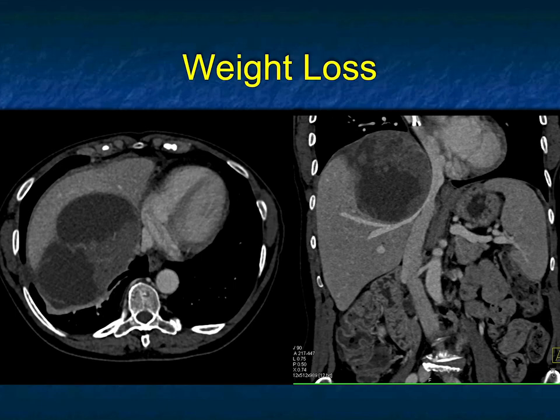The patient has already had a TAH and BSO. This was metastatic ovarian cancer. It's not a simple cyst, obviously — there's thickening of the wall, and of course there's soft tissue nodularity. A beautiful example of metastatic ovarian cancer.